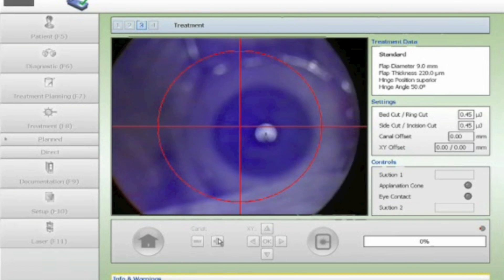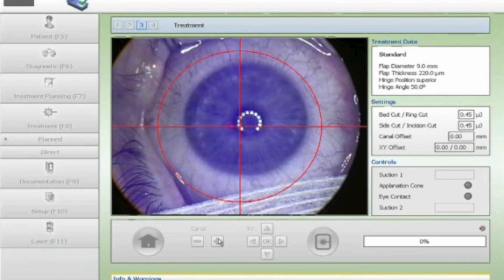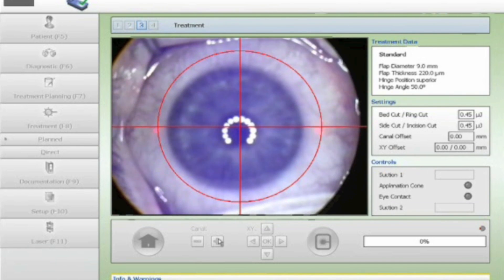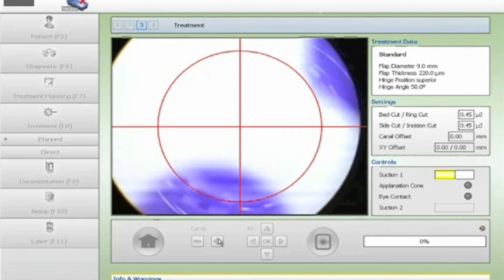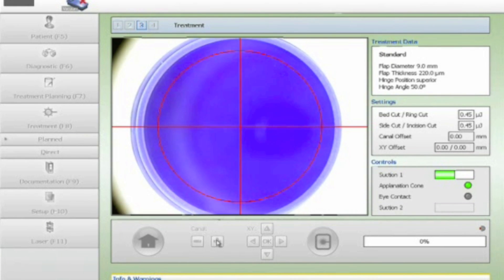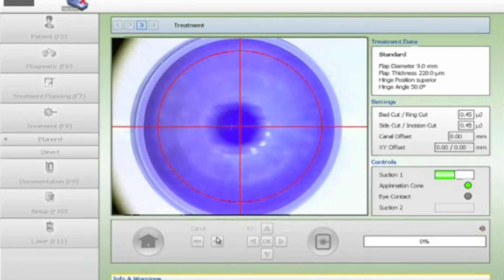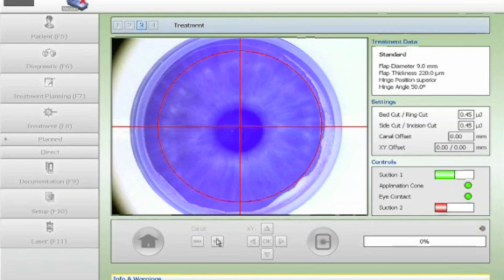Try and look into the ring of light — as it gets closer it'll look like a tunnel of light. This is the part where you're going to become aware of a pressure feeling, and as the pressure goes up you typically lose vision. The first vacuum is engaged with the suction ring on the eye; the second vacuum is automatically engaged and this is when the cone applinates the cornea within the suction ring. Initially the bar indicates red but as the suction improves it changes through yellow to green.